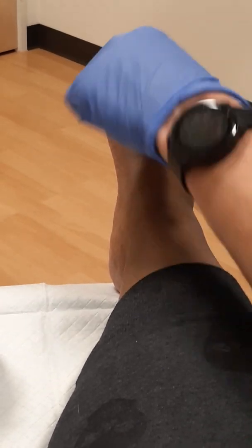That needle looks big. It's not. It's actually a tiny little needle. It's just long. That's all. It's actually a very, very small needle, so that it doesn't hurt as bad. In terms of pain with needles, it's all the size of the diameter of the needle. This is a very, very small needle. Okay? So one here, one there.